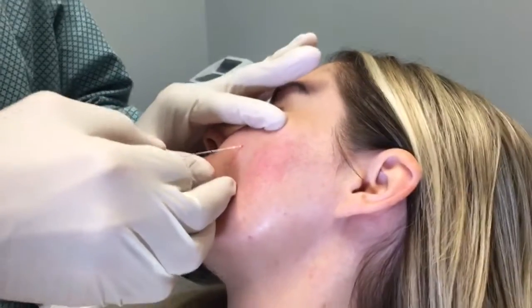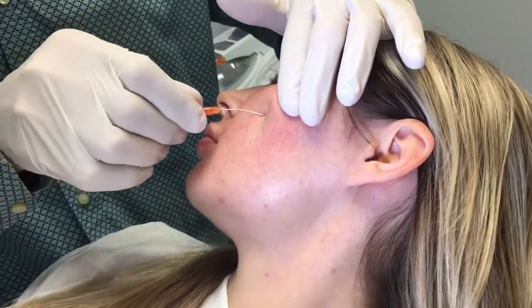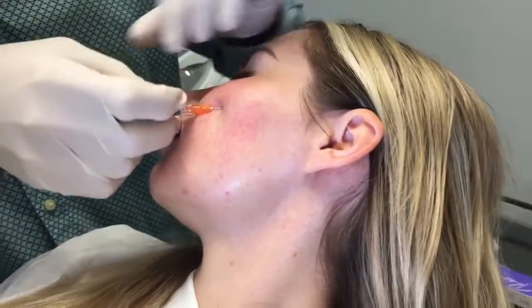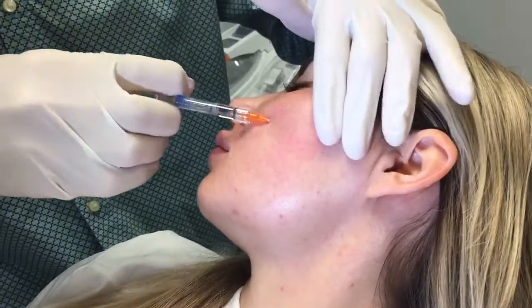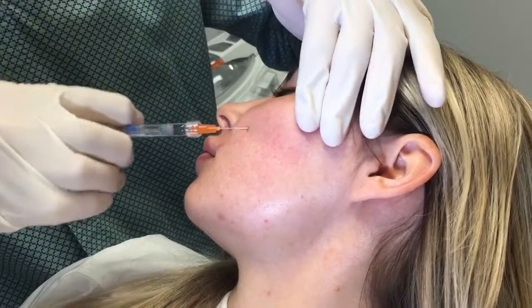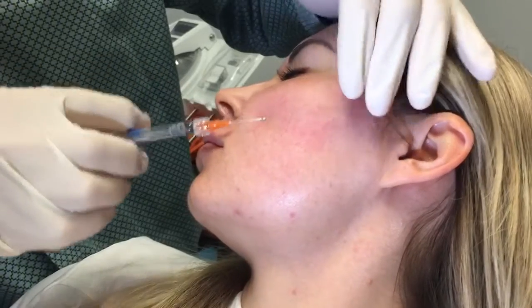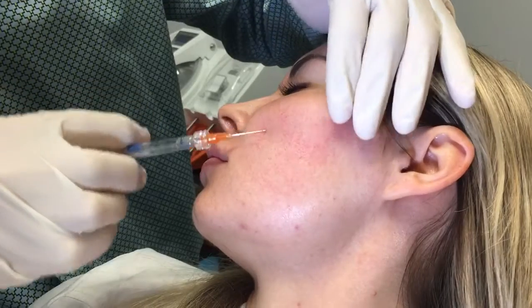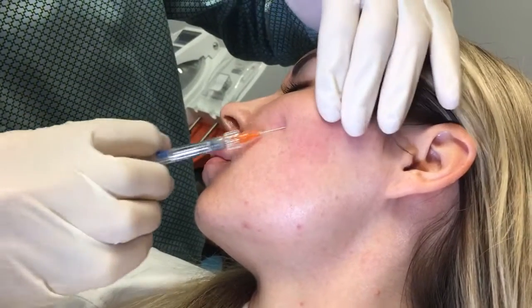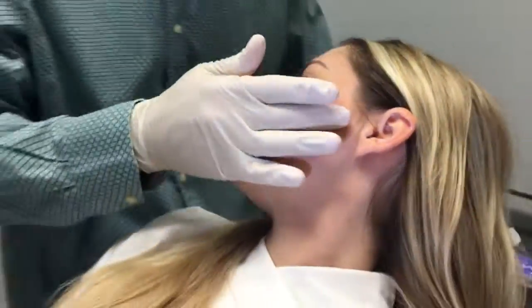I've done a pilot hole right here, and I'm going to insert my cannula right inside that pilot hole. And what I do is I lay down very small aliquots, actually little beads of the product into the upper cheek. It's very quick and easy — we can do it in less than a minute, and that's half a syringe of Restylane Lift in the upper cheek.